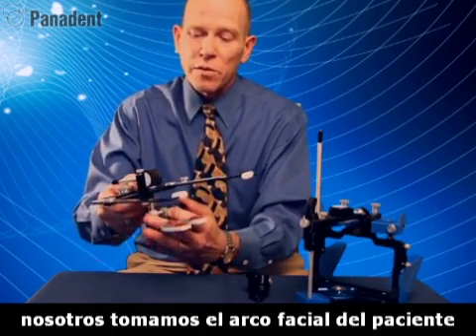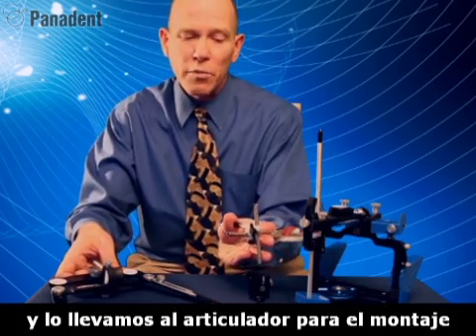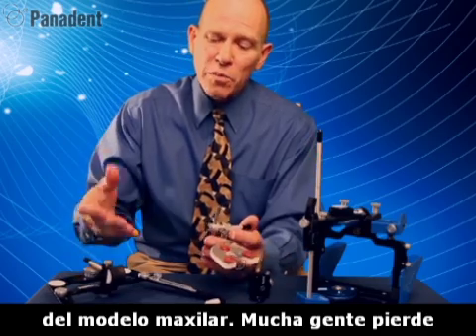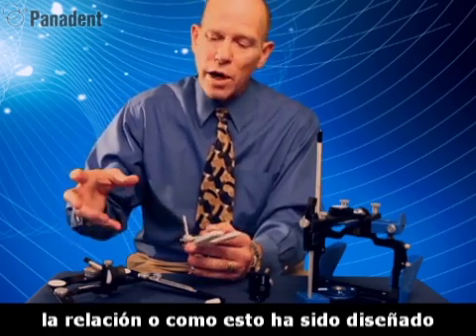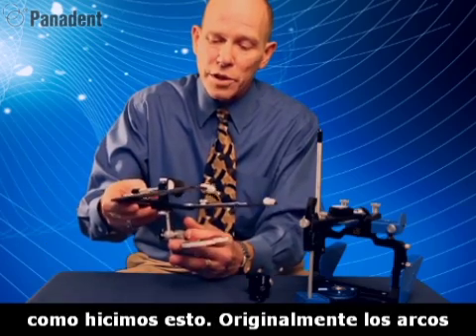Usually when we take the face bow from the patient we remove the bite fork assembly and go to the articulator for mounting the maxillary cast. But many people lose the relationship, or how this has been engineered back over to the articulator. So I'd like to show you how we do this.